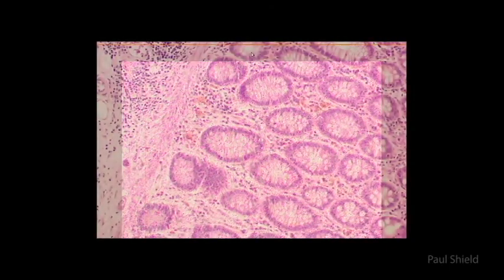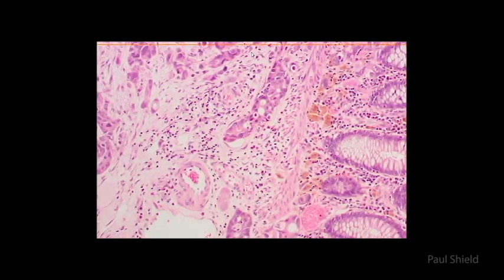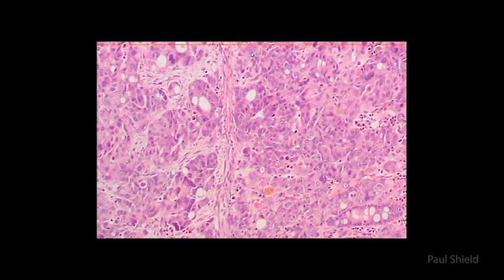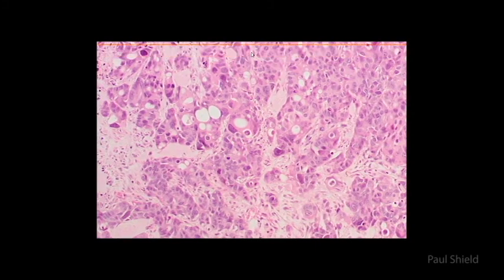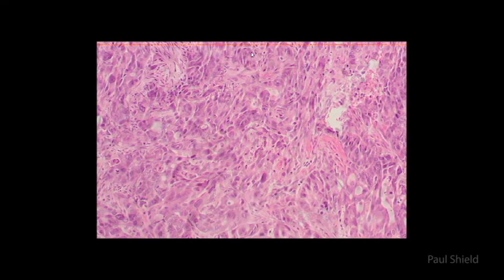If we go back to low power, you can see that actually underlying that tissue is quite a different looking tissue, and that's the tumour. It's got not nearly the same level of organisation, so that nice normal tissue on the right and the left here. You can see it's lacking that glandular formation, although there are some areas that are a little tubular, but mostly it's nests of tumour cells invading into the connective tissue, and they're taking up most of the tissue mass.